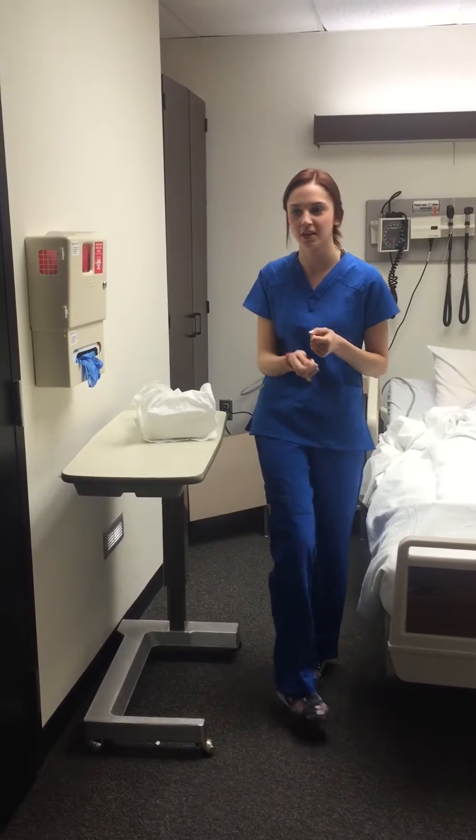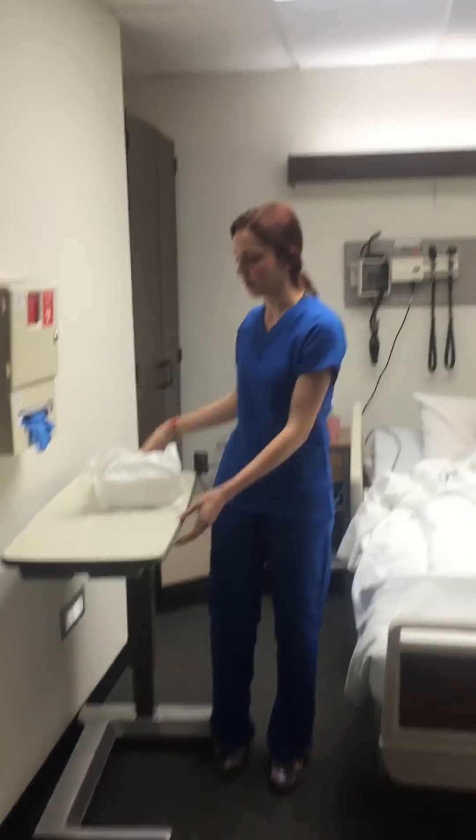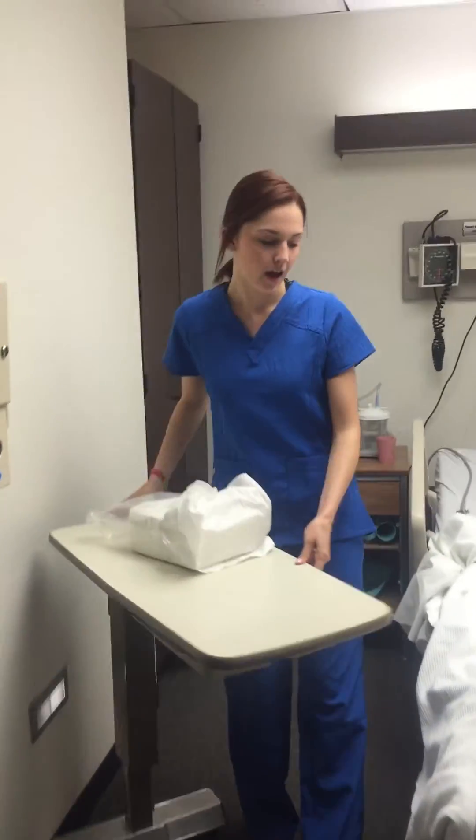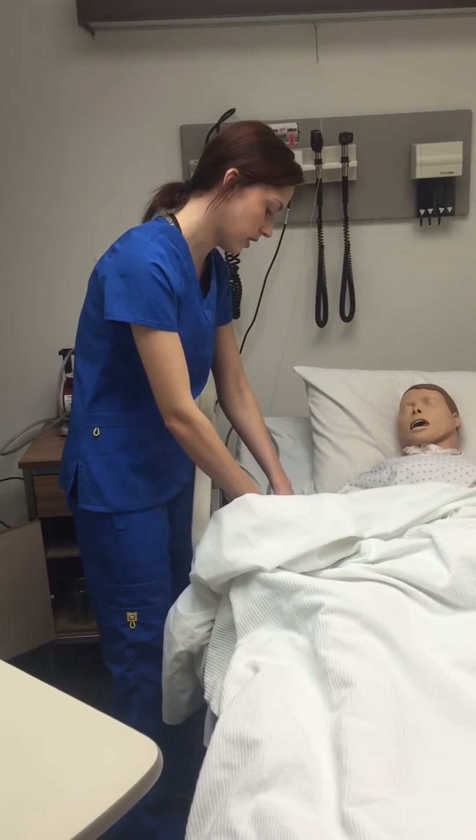I will close the curtain for privacy and then I would do hand hygiene and I would bring my supplies in with me. I would then identify the patient with two identifiers by their name and birth date.